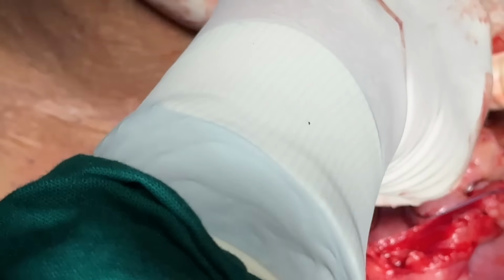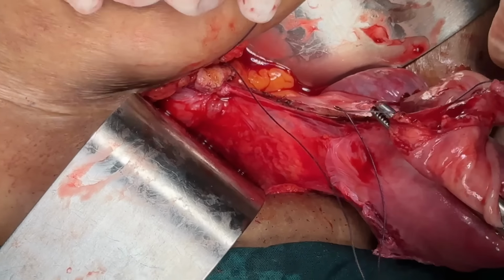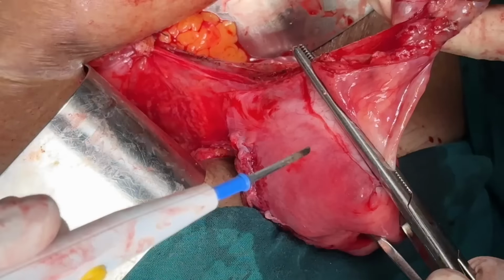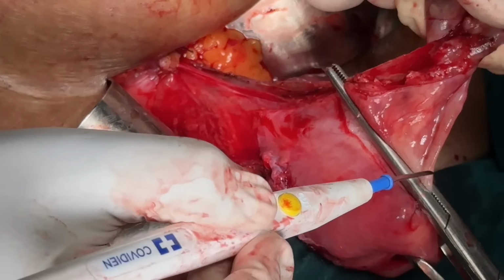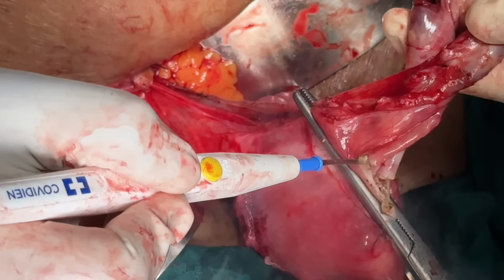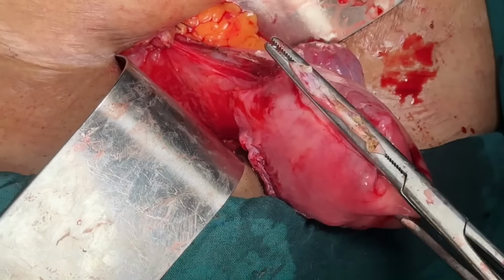If we are doing salpingectomy or salpingo-oophorectomy with hysterectomy, I prefer to remove this part once it is clamped, cut and ligated. Why? Because otherwise it keeps on hanging, keeps on disturbing and distracting throughout the remaining procedure.